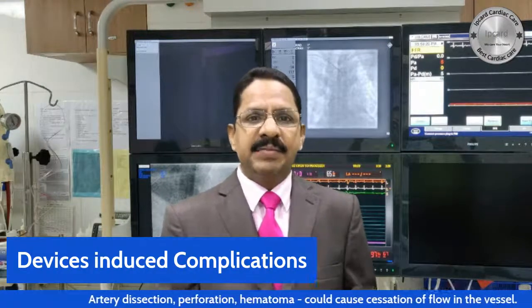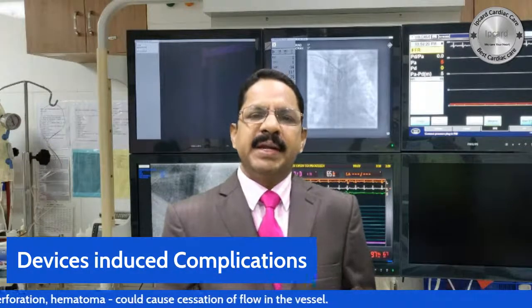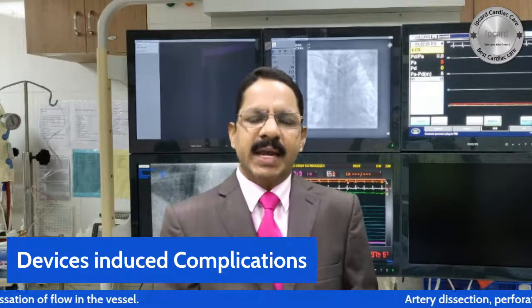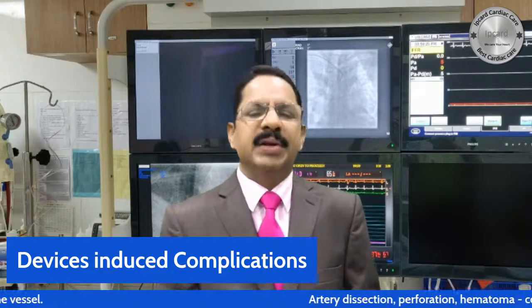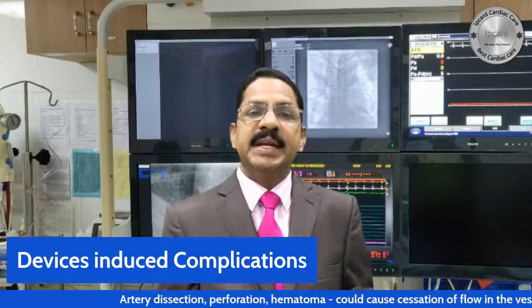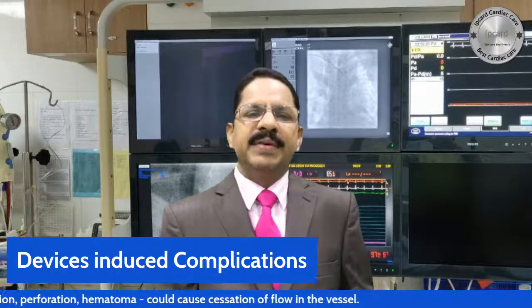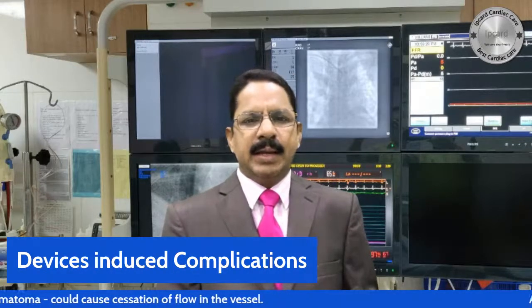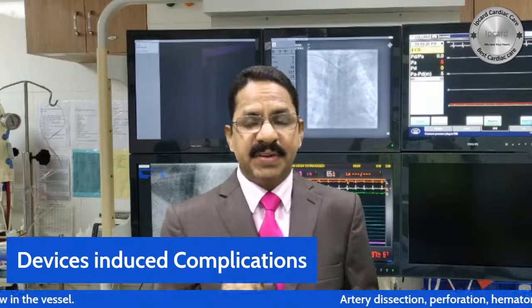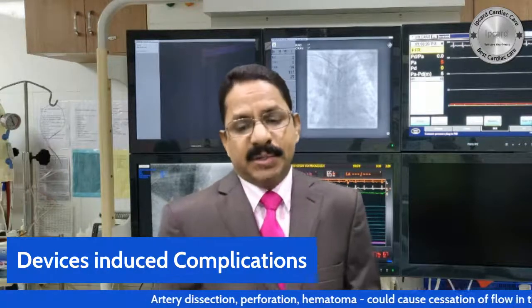When the left ventricle fails, the patient may need urgent angioplasty. In that situation, we use the IABP balloon and impeller device. Those devices are almost large bore devices. For that, we always take precautions, and accordingly we arrange the materials, concerned about patient safety. Always we look at patient safety as the first priority with any devices. So no need to worry about the device.